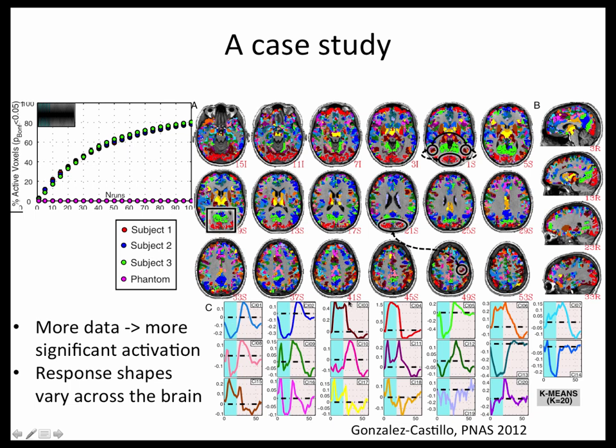Sometimes we get these little transients. Sometimes we get only a transient. So here it's a transient, then an undershoot, then a transient again. Sometimes it's flipped. It's all over. So the 2 big findings are that it varies, and when we look at the whole brain, there's a lot of cool stuff happening that we're ignoring, that we only get to see when we have 9 hours of data per volunteer.